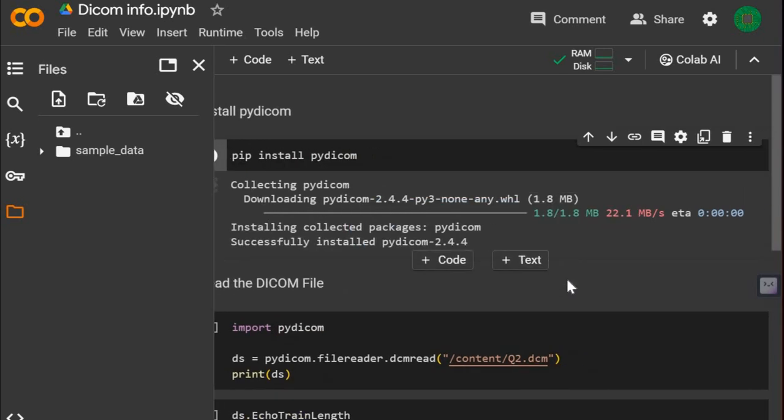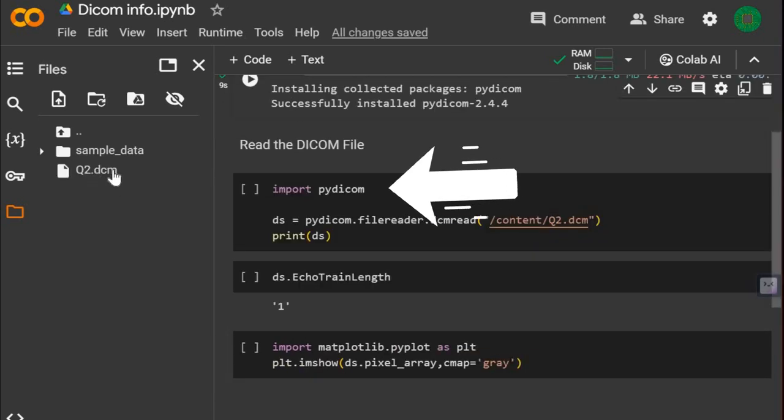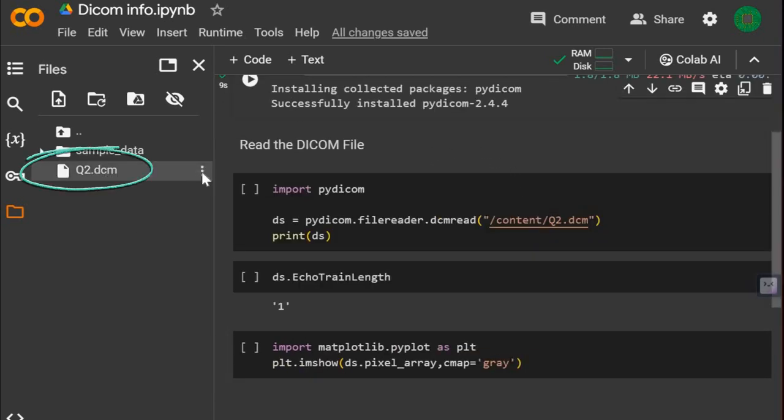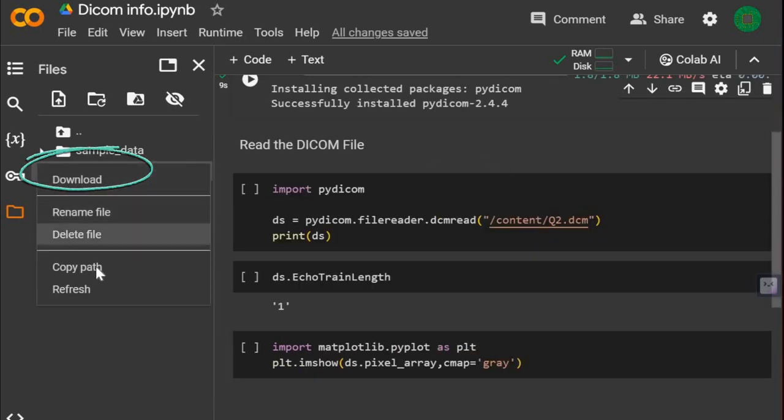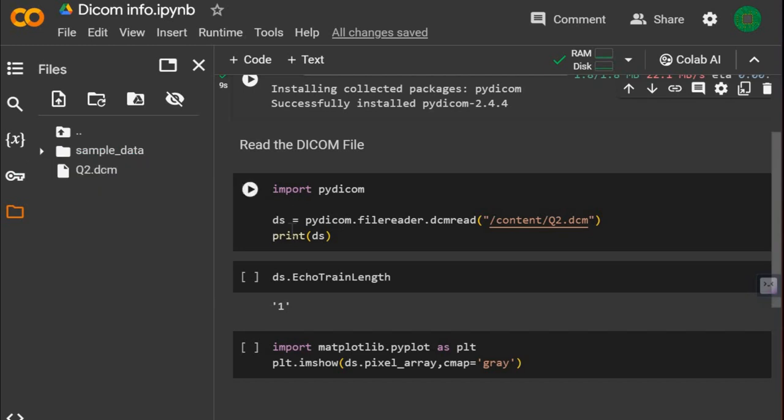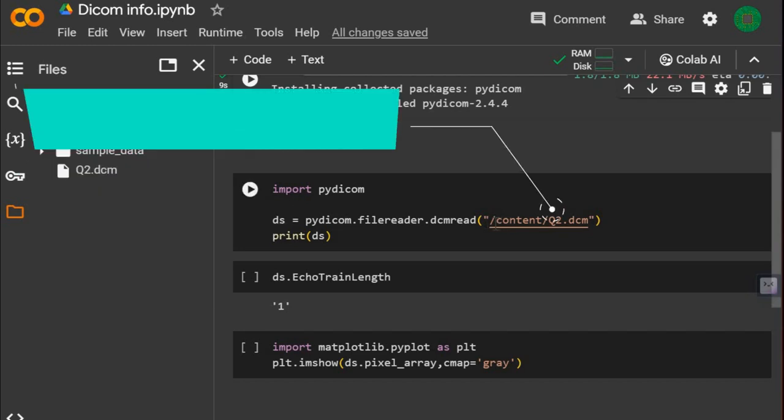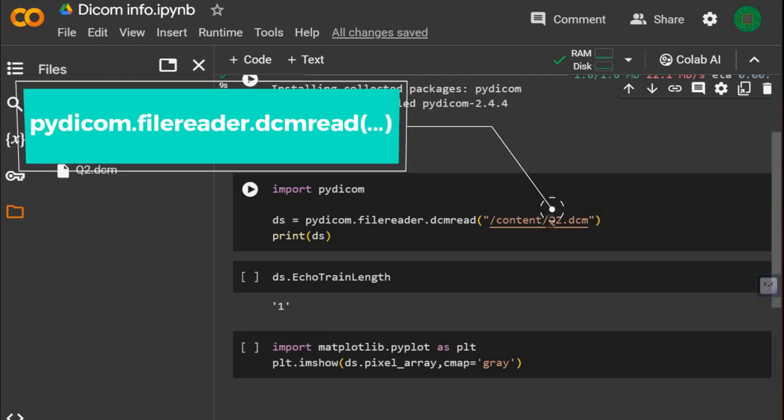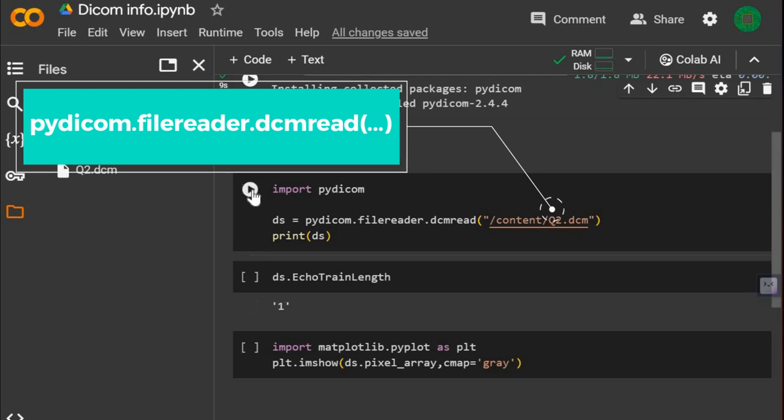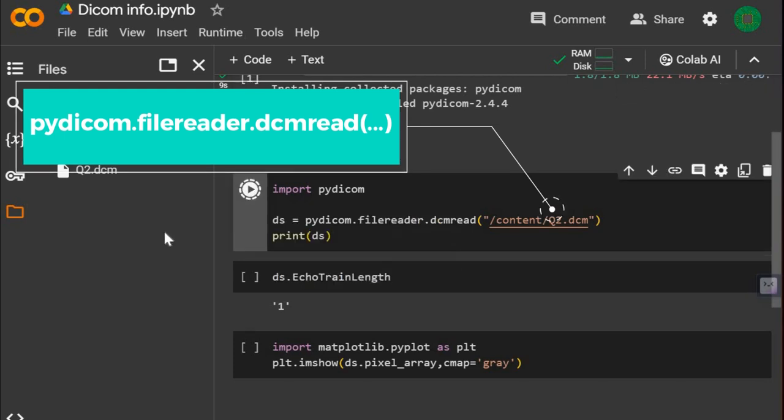After that, we import the PyDICOM library. I already have a DICOM file here, so I'll just copy the full path and then call the pydicom.filereader.dcmread function and pass the path as the argument.